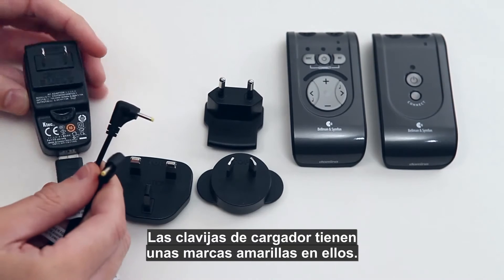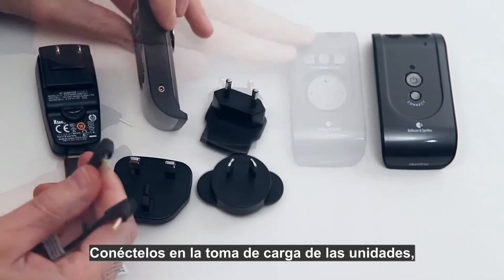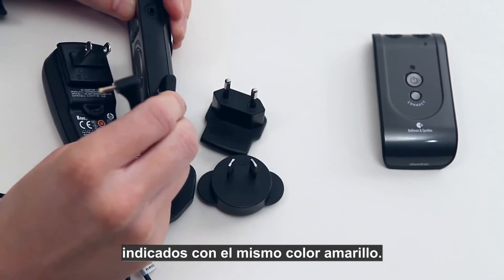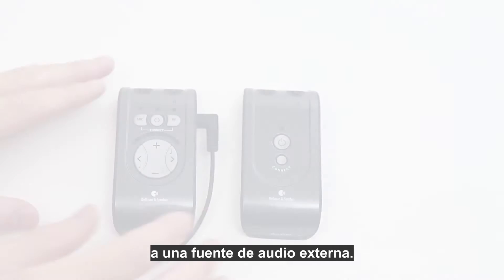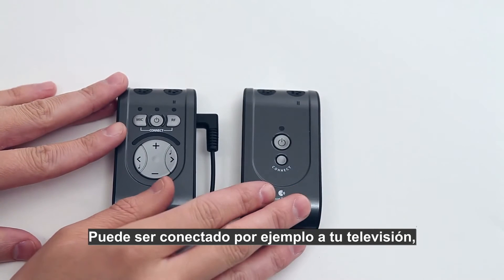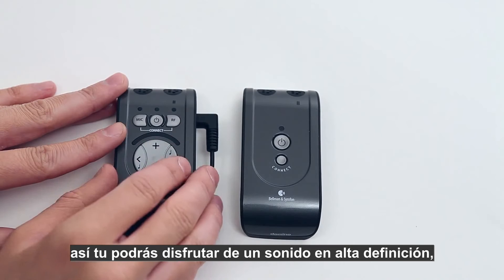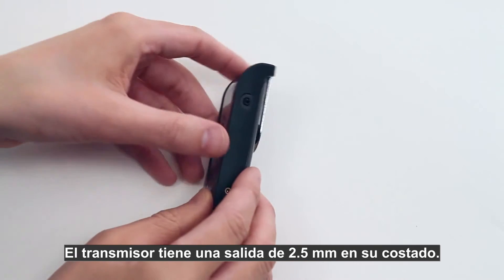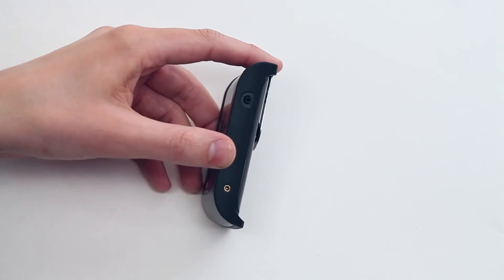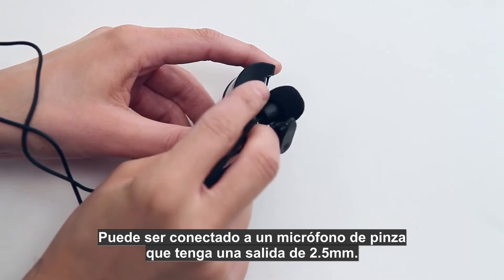The charging pins have a yellow marking on them — connect them to the charging socket on the units, also indicated by the same yellow color. Let's have a look at how to connect the Domino transmitter unit to an external sound source. It can be connected to your TV so you can enjoy high definition stereo sound totally wirelessly. The transmitter unit has a sound input on the side that can be used to connect a lapel microphone with a 2.5 millimeter telejack plug.